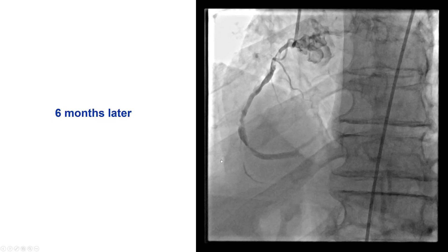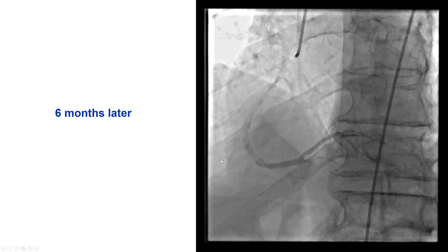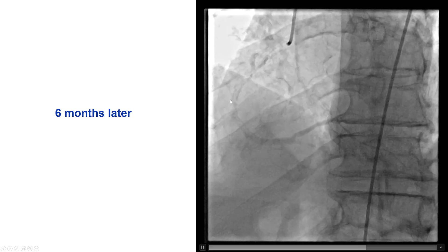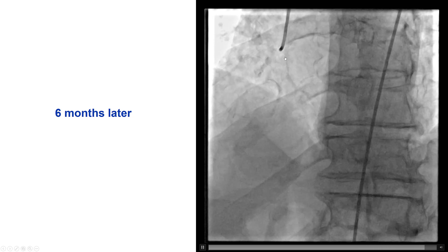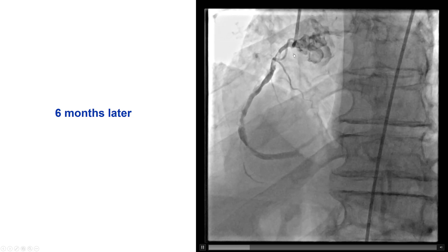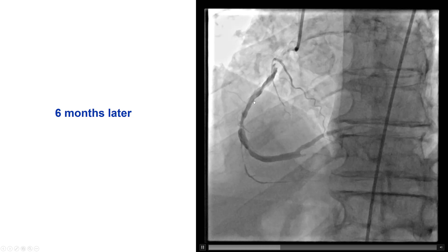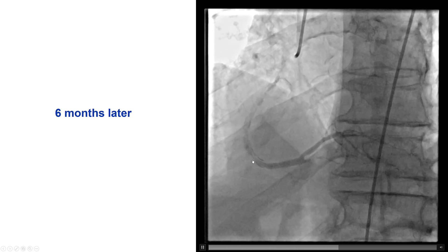The initial plan was to come back after two to three months, but due to logistical issues it was a little delayed, so he came back six months later. And this is how the angiogram looks at six months.